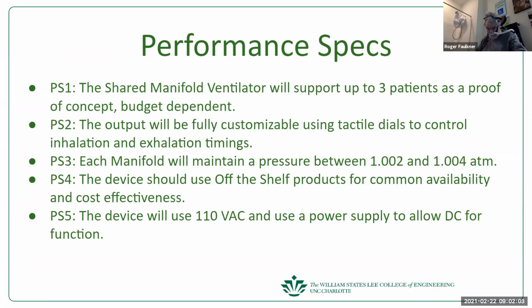So I assume, Billy, that you'll have the mechanically determined outlet pressure from the oxygen tank just a little bit above what you need in the line, and then you flutter that valve to control the pressure. You know how oxygen tanks have two regulators, high pressure and low pressure regulators.